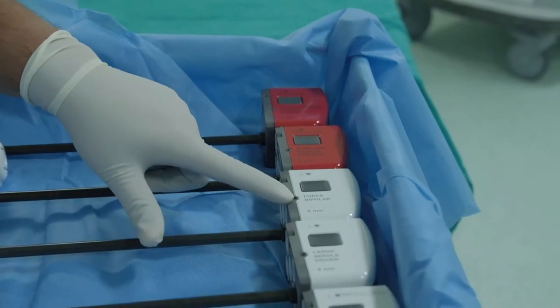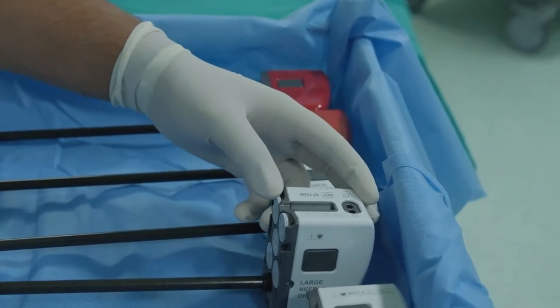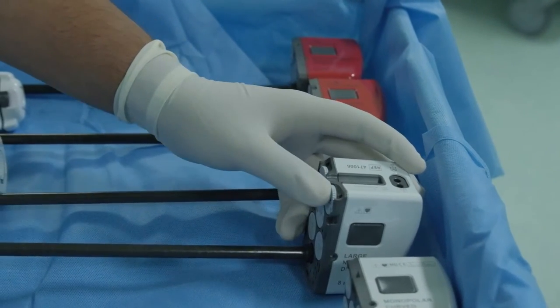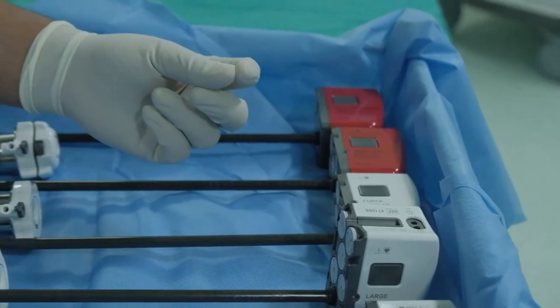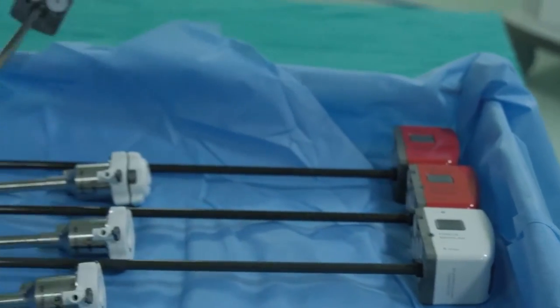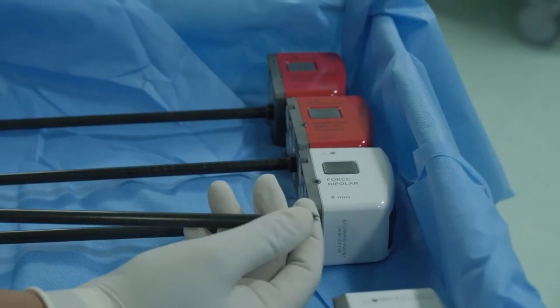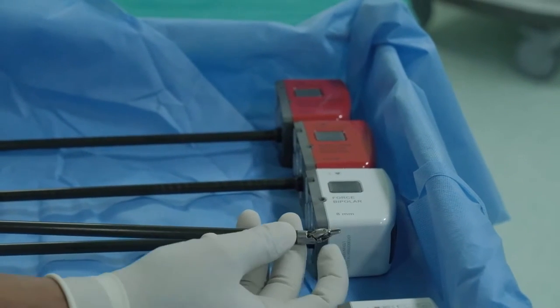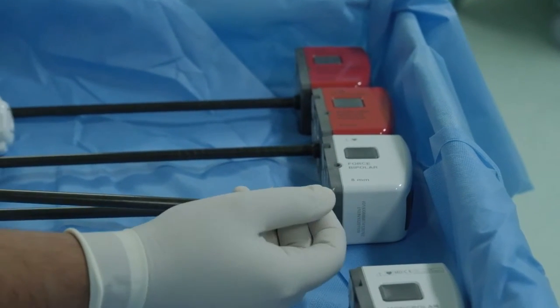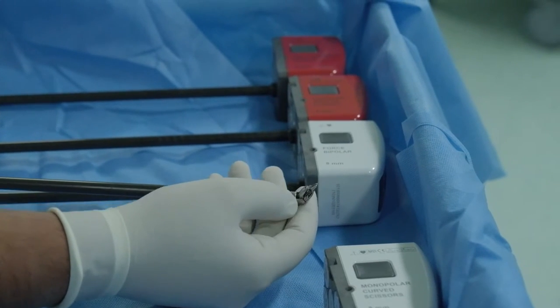So these instruments have a housing, and this is the plate where there are these discs or pulleys, which are actually going to translate the surgeon's hand movement into the tip of the instrument movement. So this tip of the instrument has 7 degrees of freedom. You can see this is a needle holder. It can move up, right, it can rotate around, and it can open and close.